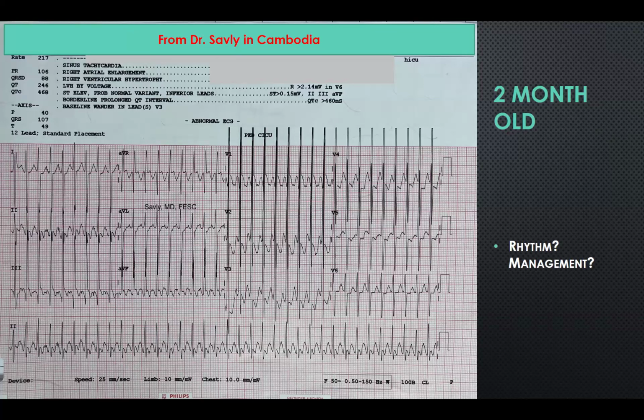It will probably be terminated. Right, the tachycardia would terminate, although always remember that sometimes it terminates and then restarts very quickly. So it's always worthwhile running the strip while you're giving the medication. If the patient is stable, I always recommend that you run a 12-lead rhythm strip as you're delivering adenosine, because sometimes it stops and starts so quickly that if you don't have it documented on the ECG, you wouldn't actually know that the adenosine worked, and you might draw an erroneous conclusion about the responsiveness to adenosine.